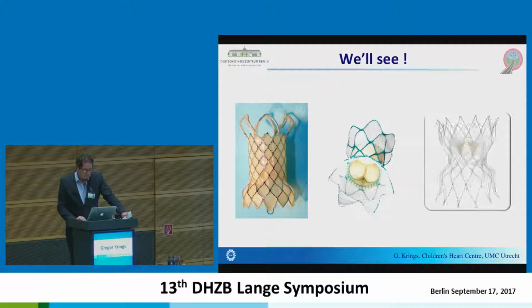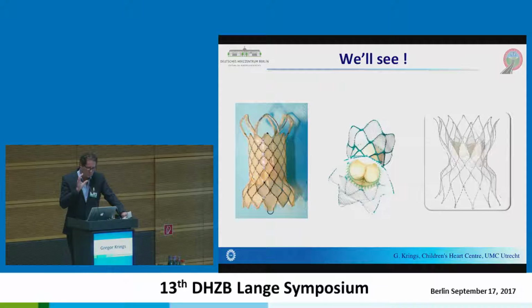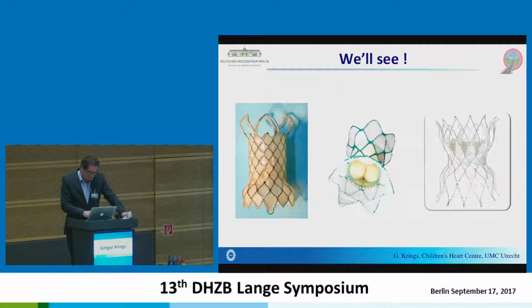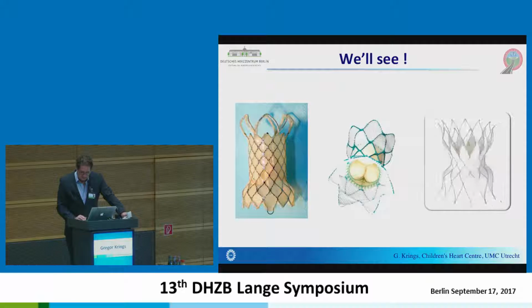So far, these are the 3 products, at least the left one, the Venus and the Harmony, which are on the market. I would emphasize again, I think it's probably a good idea to do a division, to divide the problem of a huge valve in a huge MPA, give the geometric problem to the carrier, and then put in the valve. But there's a lot to discuss, and again, this is just before any kind of clinical trial, and I look forward to what will happen.